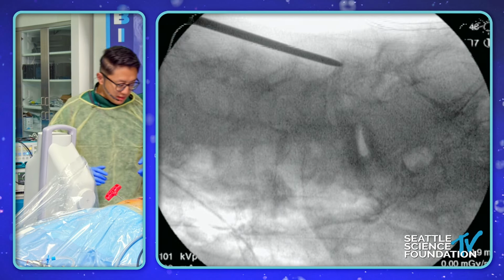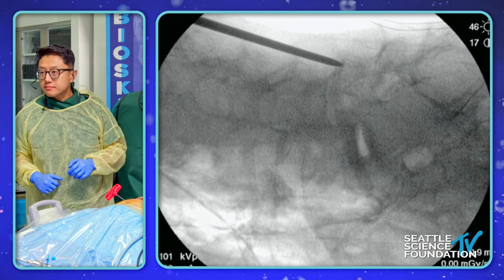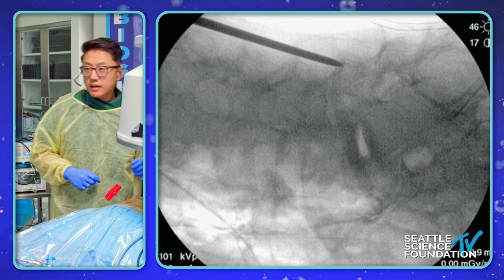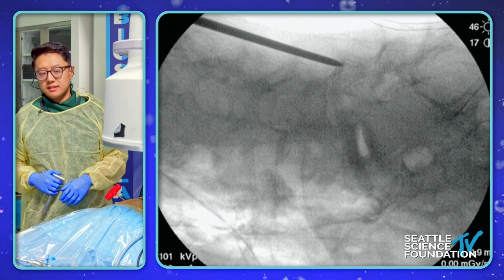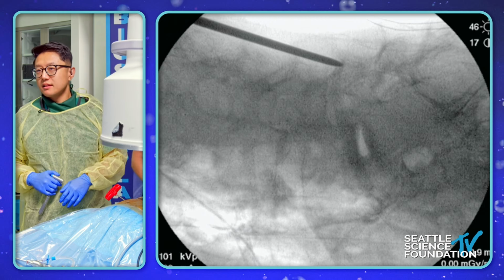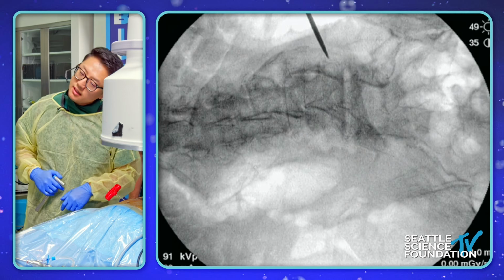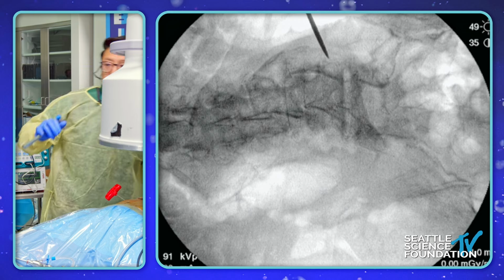Okay, so let's get back to AP. Where's the mallet? Thank you. Is this a straight AP? You're at 0? Okay.